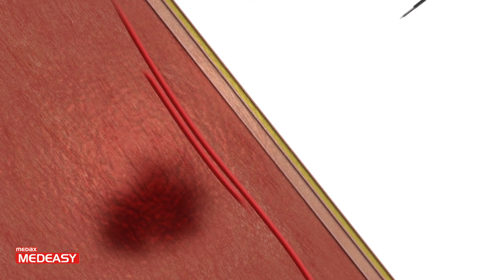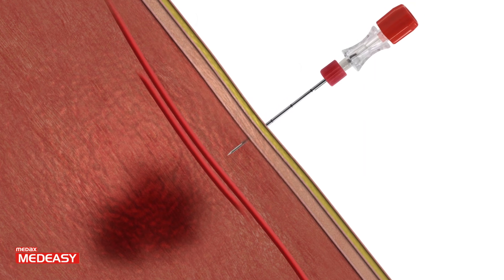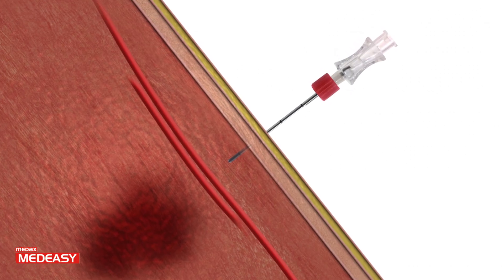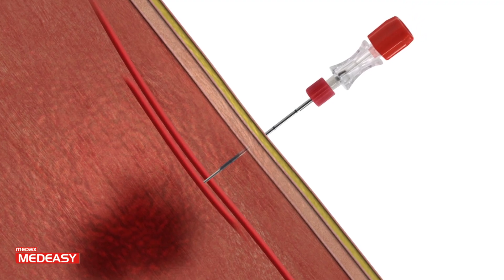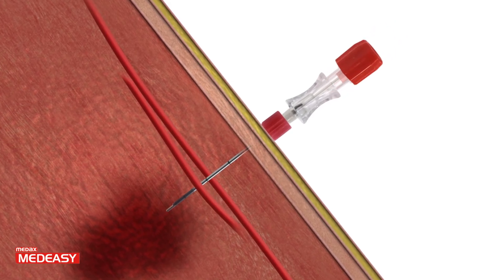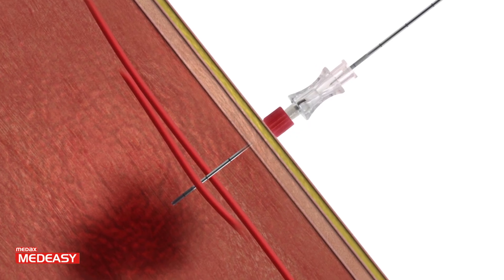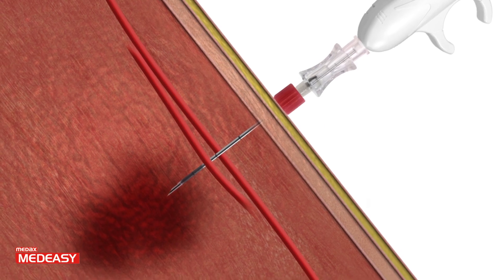If the biopsy area is close to or behind blood vessels or internal vital organs, a special atraumatic blunt tip stylet can be used to reach the target area in order to reduce the risk of unintentional damage. When the lesion border has been reached, remove the blunt tip stylet making sure not to remove the coaxial cannula, and proceed with the biopsy as usual.